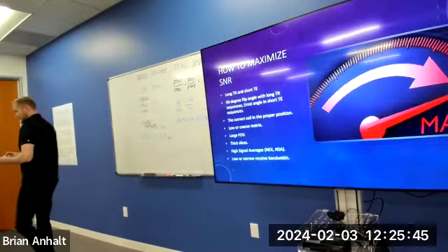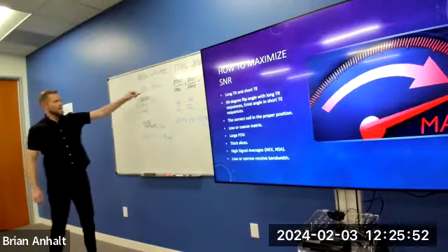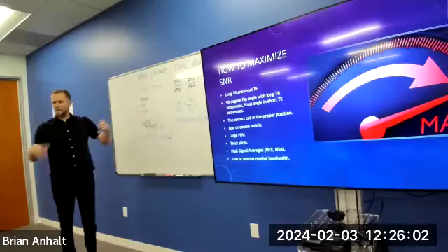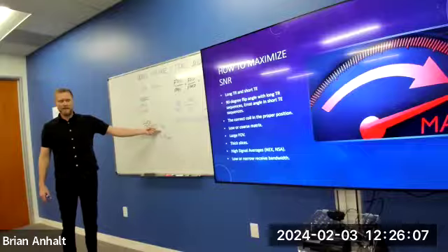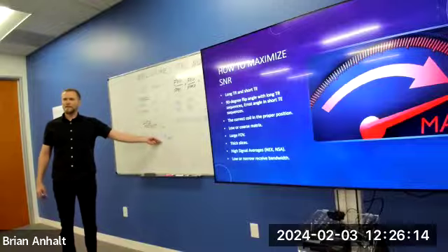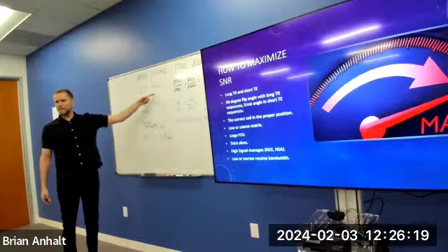Much smaller than our last scenario, right? And the reason for that is threefold. Field of view is much smaller. It was 300 millimeters before, right? So we shrunk our field of view. Our matrix is finer. It was 320 by 192 before. Now it's 384 by 224. So we're cutting a smaller view into more pieces. And then we have half the slice thickness, right? So before it was 8 something, right? 8.7. Now it's 1.14. That's because thinner slice, finer matrix, smaller field of view.